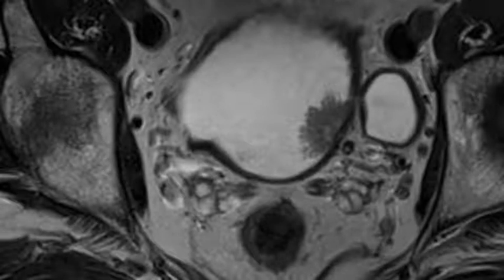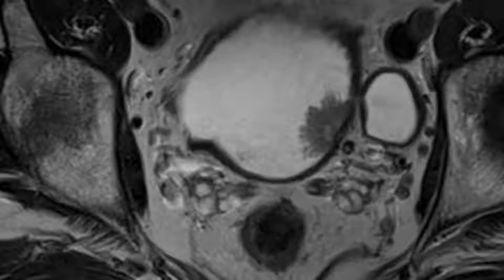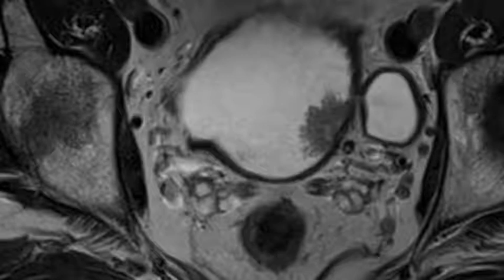MR imaging has also been shown to better depict intramural tumor invasion as well as extravesical extension and allows differentiation between muscle-invasive and non-muscle invasive disease. In addition, MR imaging has the advantage of involving no ionizing radiation. Currently, for local staging of bladder cancer, a multiparametric approach with conventional and functional sequences is useful.